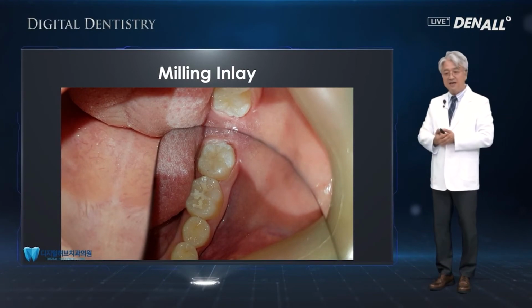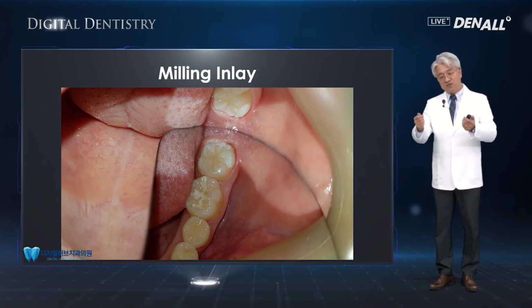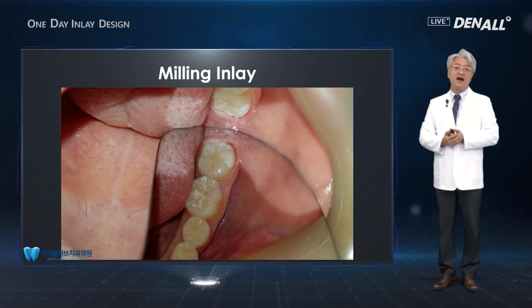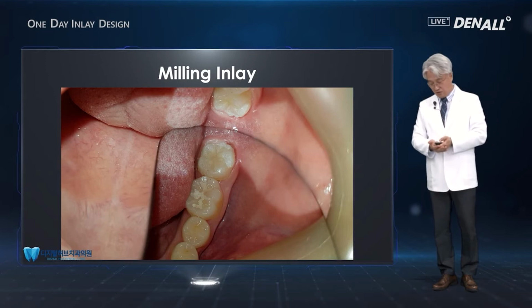And the bonding material is resin cement, so it's very good for bonding. Even if it's not the best fit or if there's a dead space, the resin cement can cover it. And clinically, the CAD/CAM inlay advantage is that it can give you much better results.